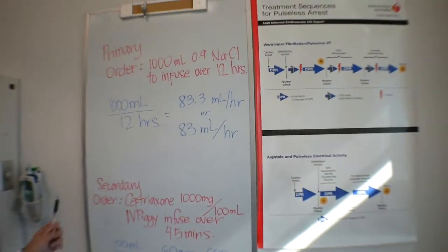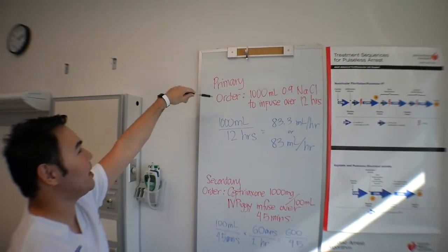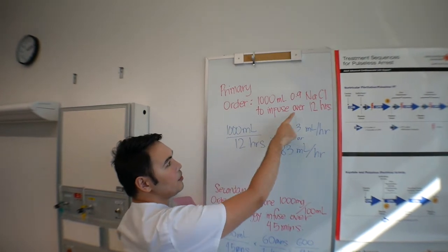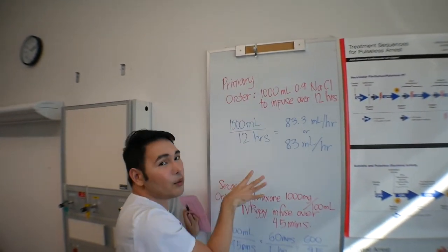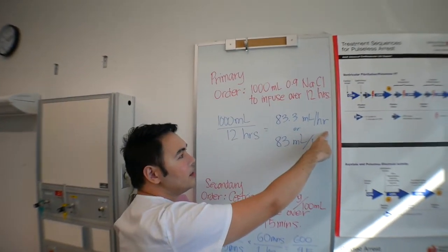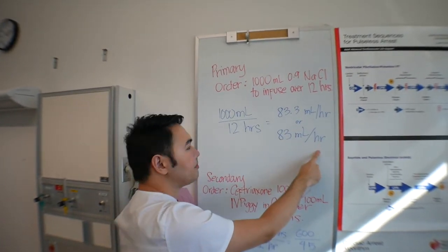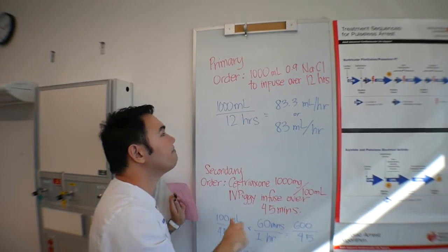Alright, so I've set up a problem and a solution here. This is going to be your primary. It says 1,000 ml to infuse over 12 hours. So this is easy. You're just going to divide 1,000 over 12, and it's going to give you 83.3 per hour. Since we're doing adult, we're going to round it off to 83 ml per hour. This is how you will set it up on your pump.